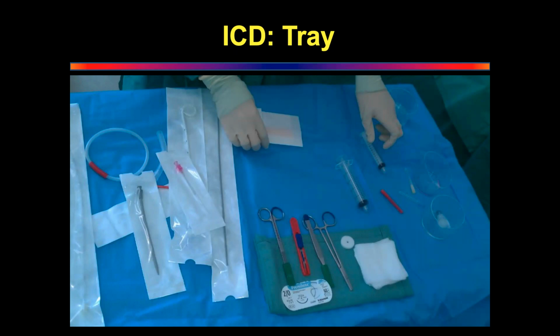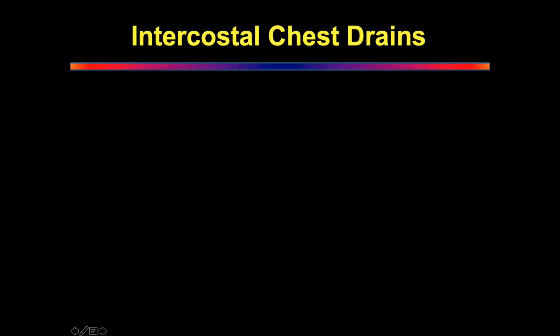This is very important. Why? It will kink otherwise inside. Otherwise, the guide wire might go inside. The guide wire is lost inside. Kinking is not the problem. The guide wire will be left inside. If you start pushing without the guide wire coming out on the other side and somebody holding the guide wire, then you will lose the guide wire into the chest. Okay? All right. Well done. Well done, Vivek. Okay. So what are the types of chest drains that you know?